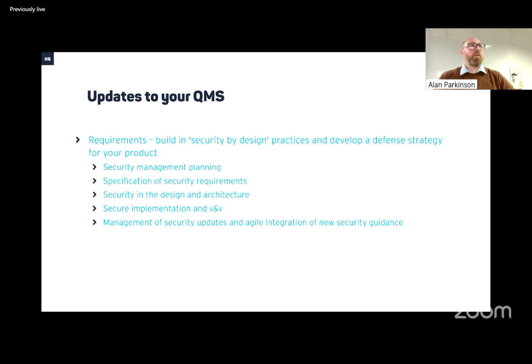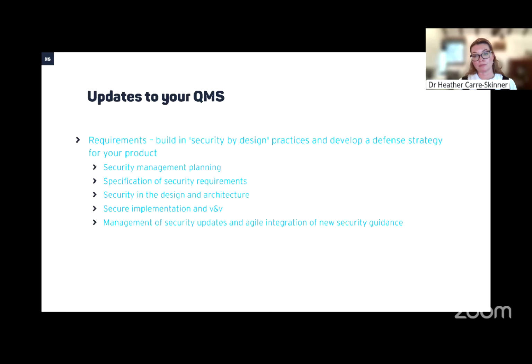So just a few updates to your QMS, Heather. Yeah, so the big one is requirements. So build in security by design practices and develop a defense strategy for your product. So if you are following the standards, then you'll be looking at security management planning, specification of your security requirements. Again, what Alan said, you don't necessarily need to have all of these up front.